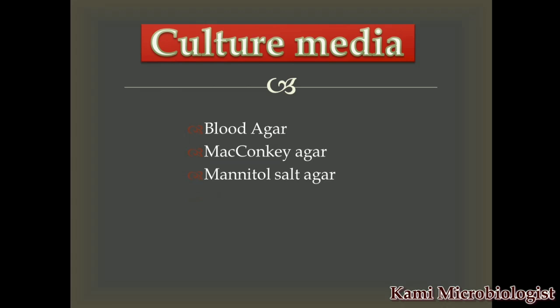Next we have mannitol salt agar, which is a selective medium especially for Staph aureus. Next we have CLED agar. Why is CLED agar used? Because, as we already talked, CLED agar is specially used for urinary infection, and the bacteria I told you about can also cause UTI. So if we use CLED agar, these bacteria will also grow, because they can cause UTI, and then UTI leads to prostatitis. So we will use CLED agar when we perform prostatic fluid culture and sensitivity.